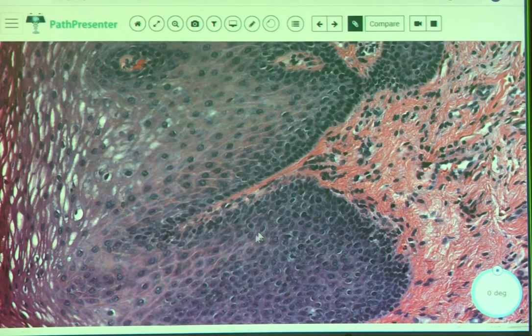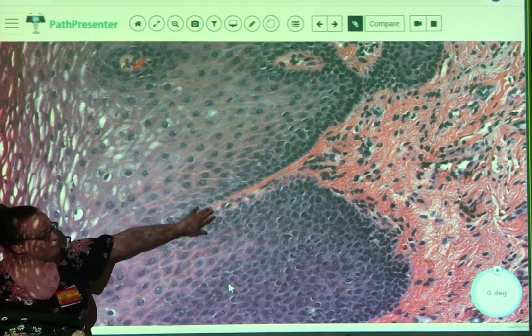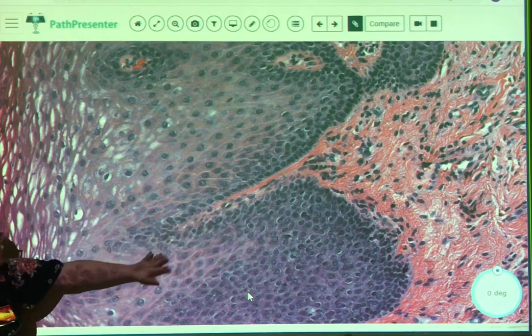Less, like it's more hypercellularity here. And it's like haphazard as well, right? Big words, okay. I'm going, it's blue, whereas this looks more pink, right? Your blue is like right at the bottom, mm-hmm, but this is like a sea of blue.